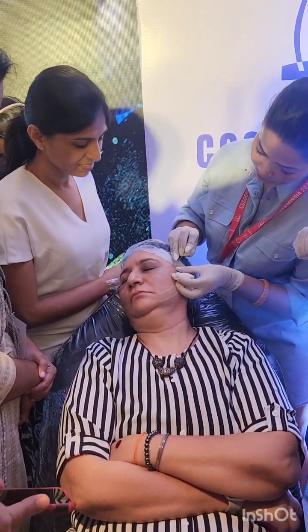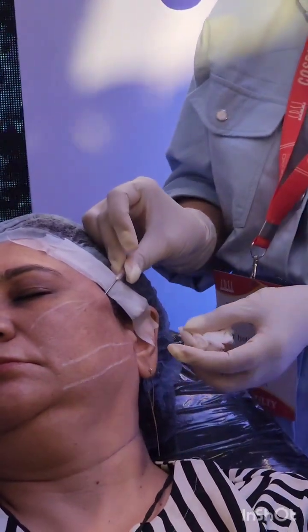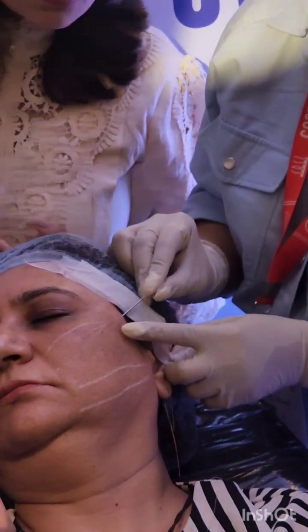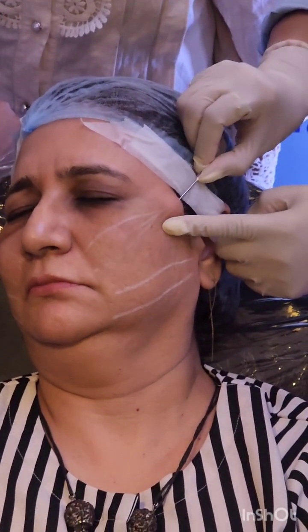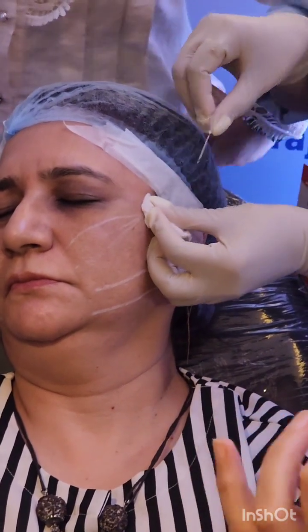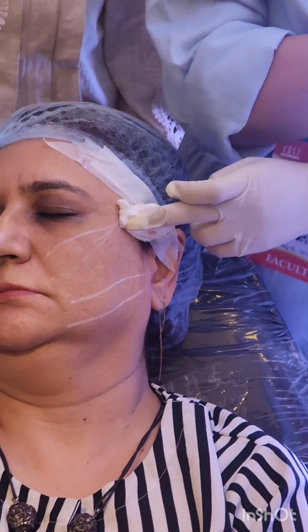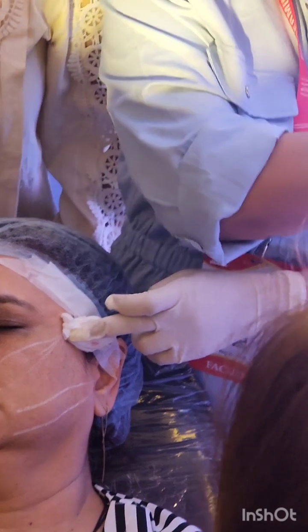So she was wearing a traditional dress. Again, see, I'm not able to lift it because I've gone to the muscles, just to show you. Then pull back a little. I can lift it. Okay. It's hurting, ma'am? Sorry. Is it okay now? You need to rotate very slowly, just at the entry point, to create the entry point. And compared to the cog, these needles are a little slimmer. So that's also the benefit.